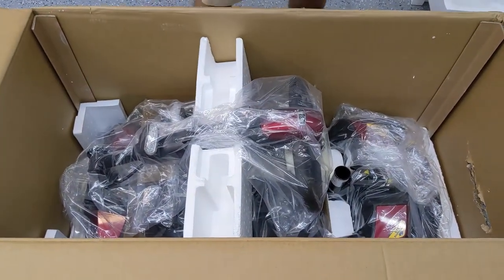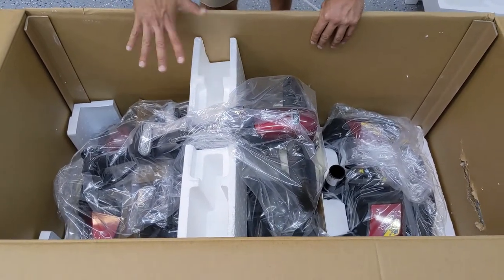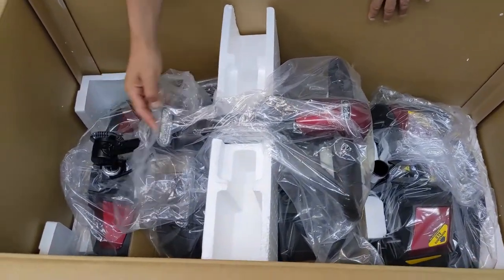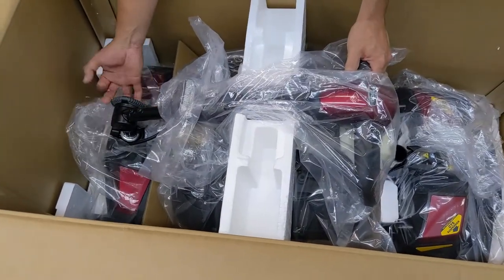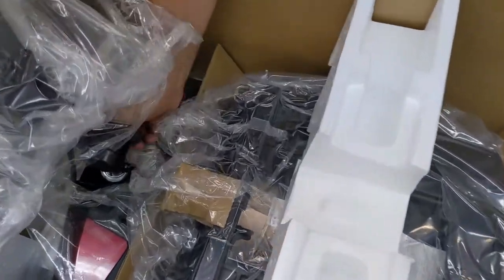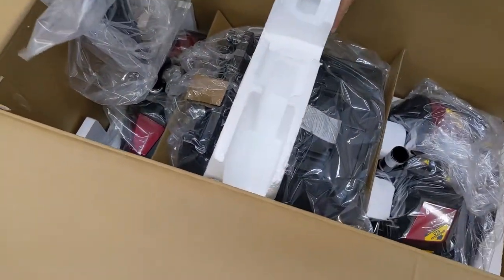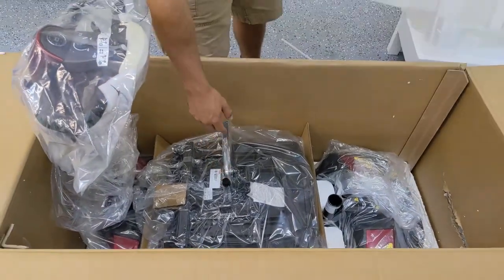At this point, once you've removed all of the components and you're left with only the tiller showing and a piece of styrofoam underneath, you'll want to expose the tiller adjustment knob on the right-hand side. Rotate it counterclockwise, lift it up, and then rotate it back clockwise so that the tiller is locked into place in the upward position. At this point, you can remove the styrofoam that was resting over the seat post.